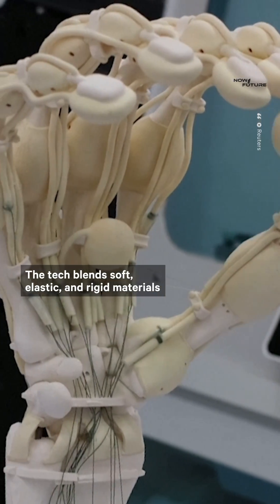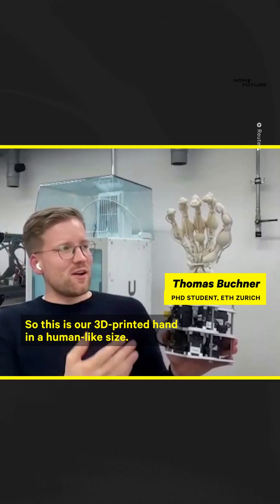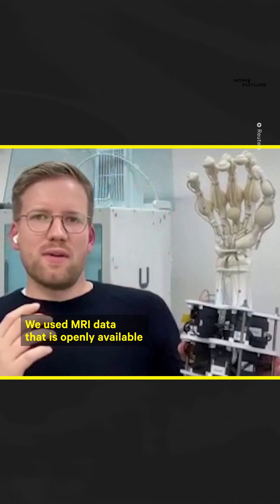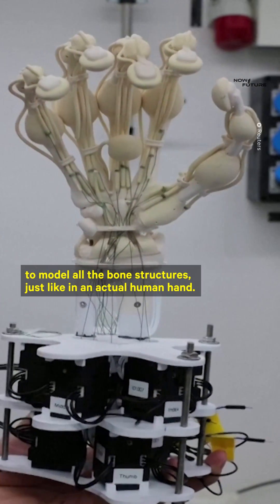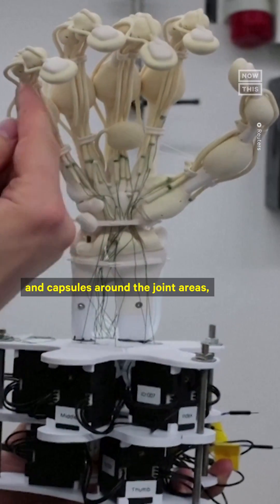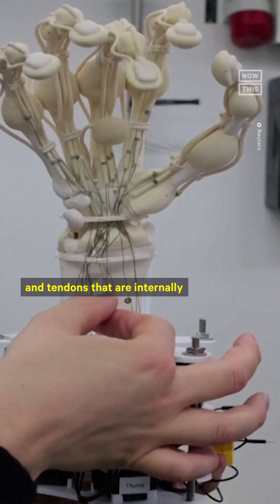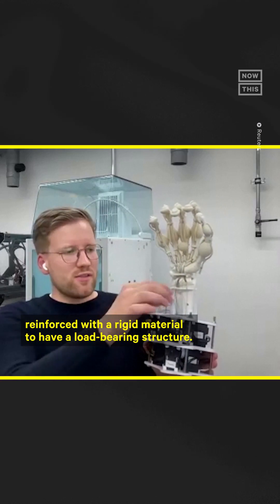The tech blends soft, elastic, and rigid materials to create the delicate structures within the hand. This is our 3D printed hand in a human-like size. We used MRI data that is openly available to model all the bone structures just like in an actual human hand. We have sections of soft tendons and capsules around the joint areas, and tendons that are internally reinforced with a rigid material to have a load-bearing structure.